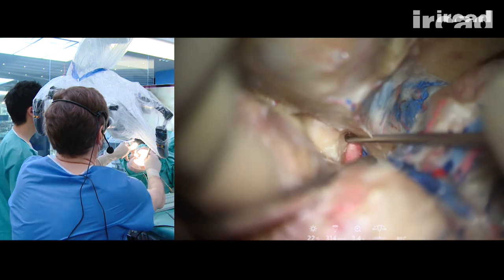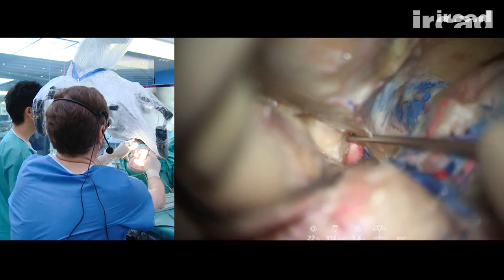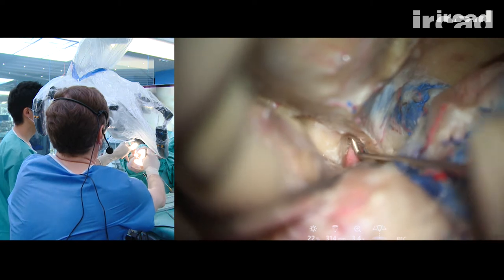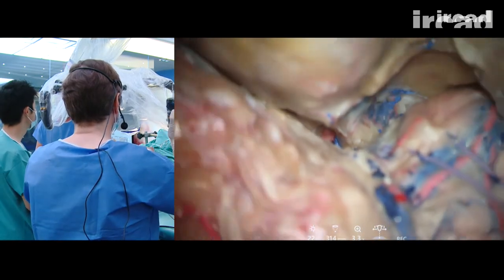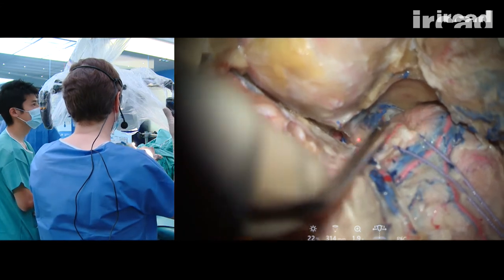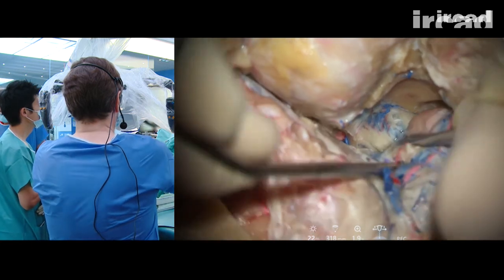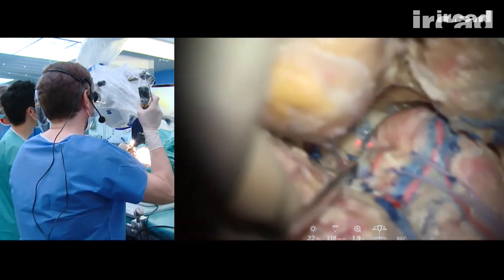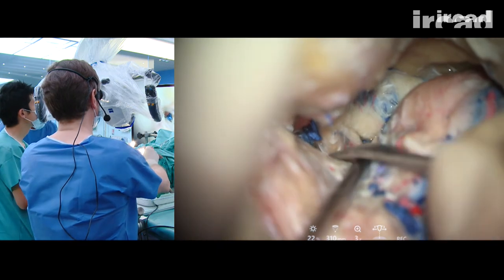I'm sure I can put, yes. Here I am in the sphenoid sinus. So this is mucosa of the sphenoid sinus. If this happens during surgery, I absolutely need to close it with bone wax and also a piece of tissue, pericranium, for example. So here is the cavernous sinus with the third nerve here.